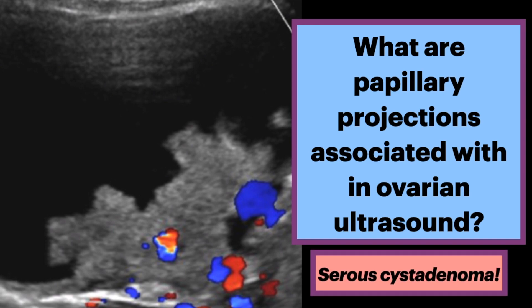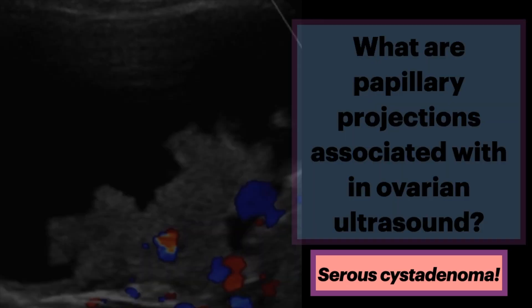Typically, serous ovarian tumors either have a few septations or are unilocular, commonly with vascular papillary projections, as seen in this case.